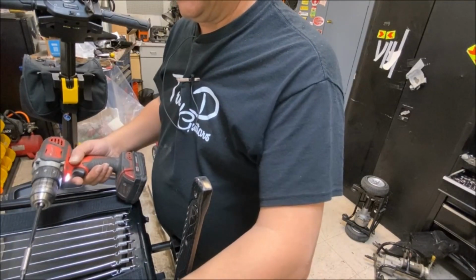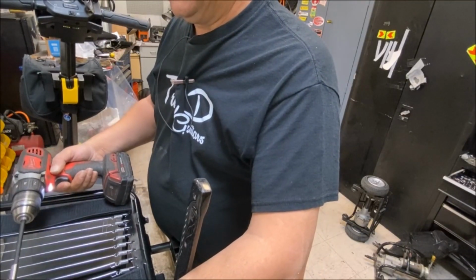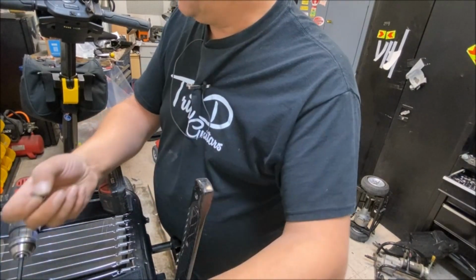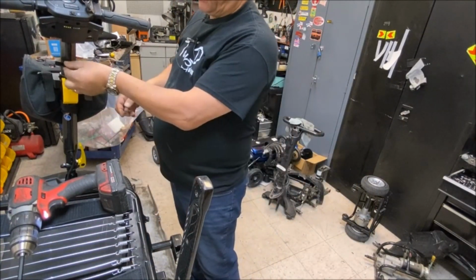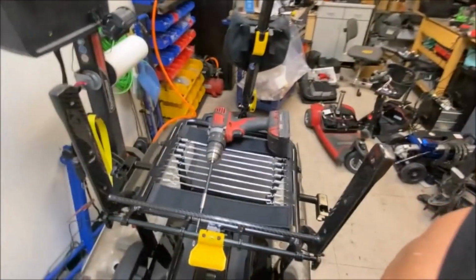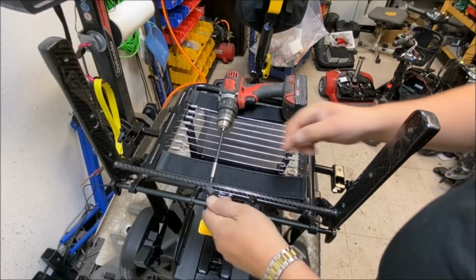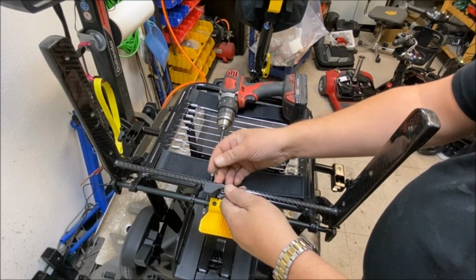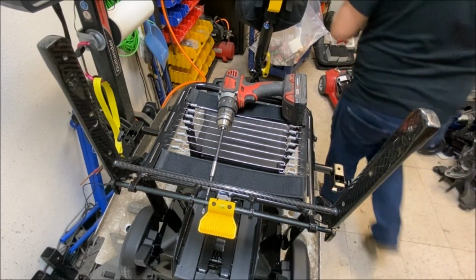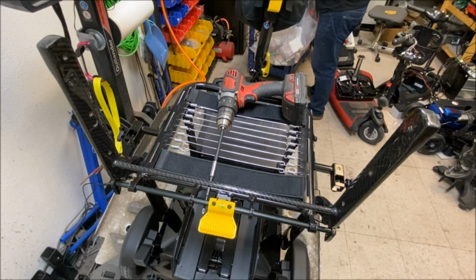What I'm removing at the moment, which is just out of the shot, is the bit that holds the tiller when it's folded. It's like a little cradle piece that attaches to the frame. I'll just show you. It's that little cradle piece that just screws into the back of the seat back frame, which I'll put back on the new piece, so one bit at a time.